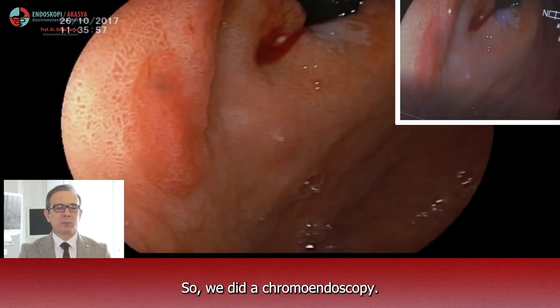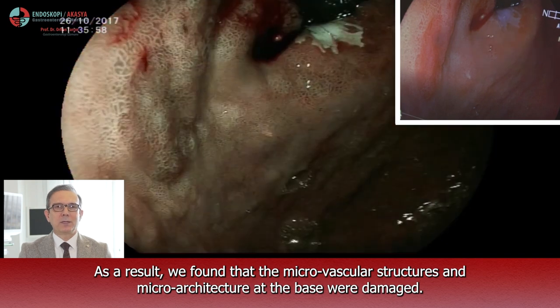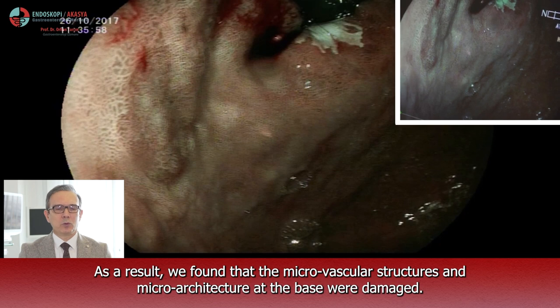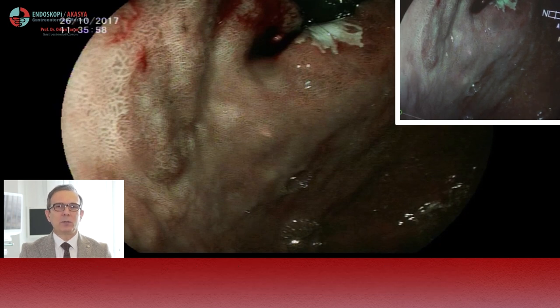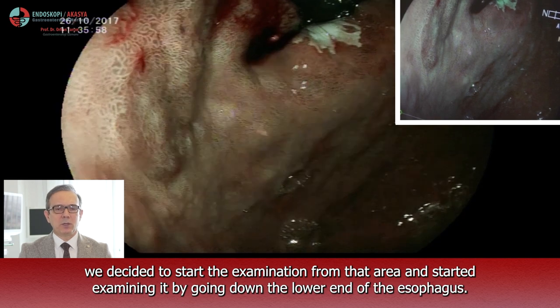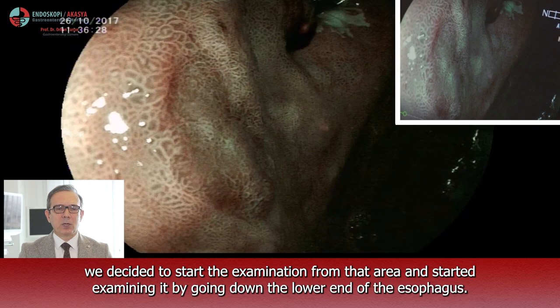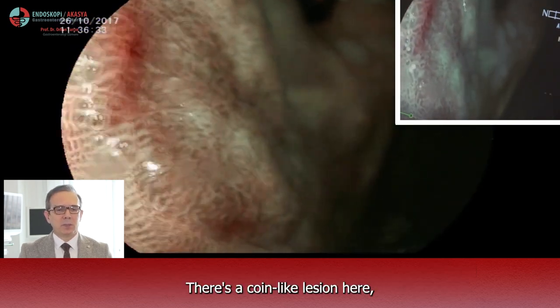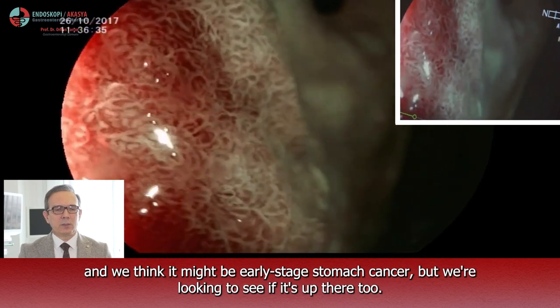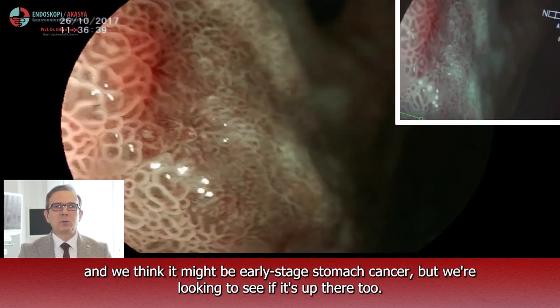So we did a chroma endoscopy. As a result, we found that the microvascular structures and microarchitectures at the base were damaged. Then, as it was close to the lower end of the esophagus, we decided to start the examination from that area and started examining it by going down the lower end of the esophagus. There is a coin-like lesion here and we think it might be early stage stomach cancer, but we are looking to see if it is up there too.